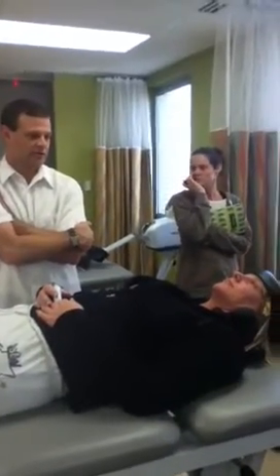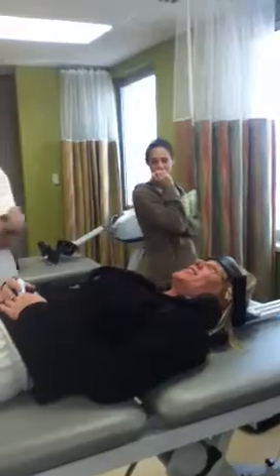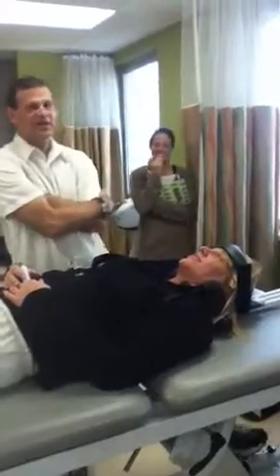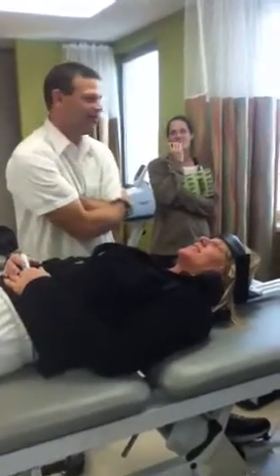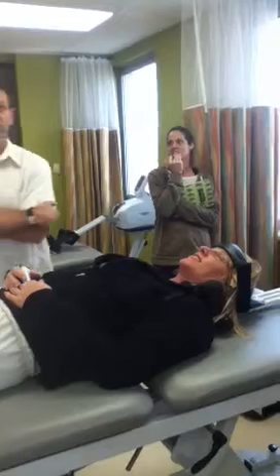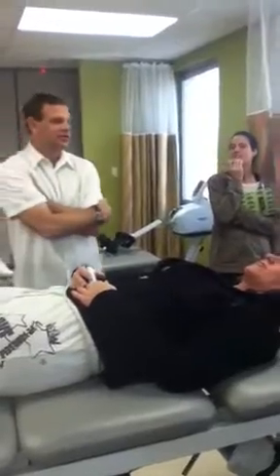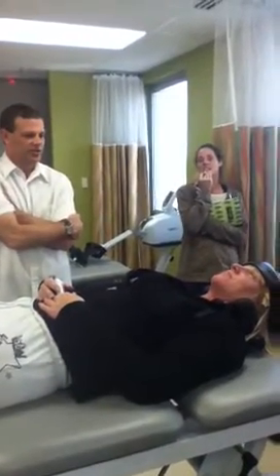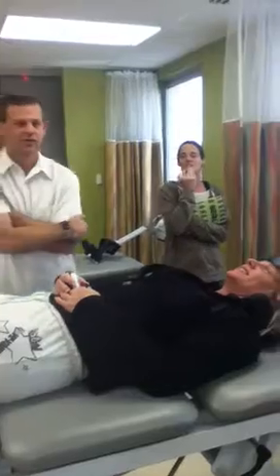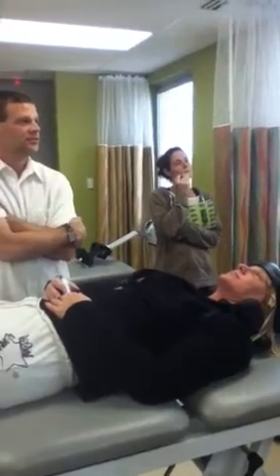Are you pregnant? No. Is there any possibility you may be pregnant? You need to say that specifically, because there are people who could potentially be pregnant who weren't trying and don't even know they are. So where did you pass our contraindications? Do you have any malignancies?